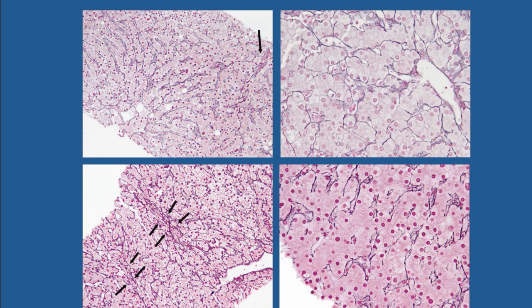Now, the reticulin stain is a fantastic stain. And I just want to quote Dr. Geller. He always says that the trichrome is beautiful for taking pictures, but it's the reticulin stain that usually gives you the most information. I will also add that the reticulin stain is a very difficult stain to do. Not every lab gets it correct. I am fortunate that my lab does a beautiful, beautiful reticulin stain.